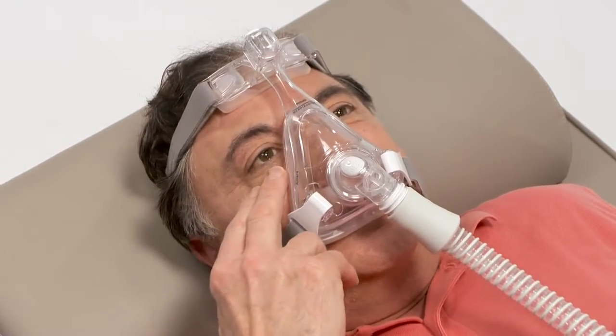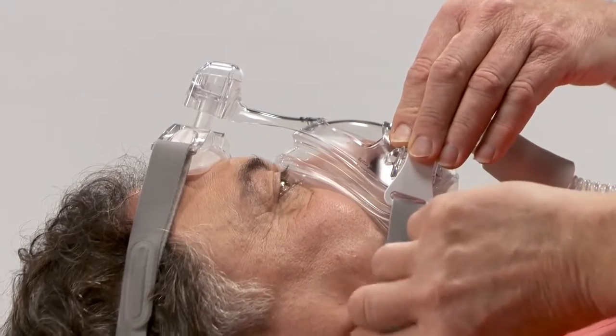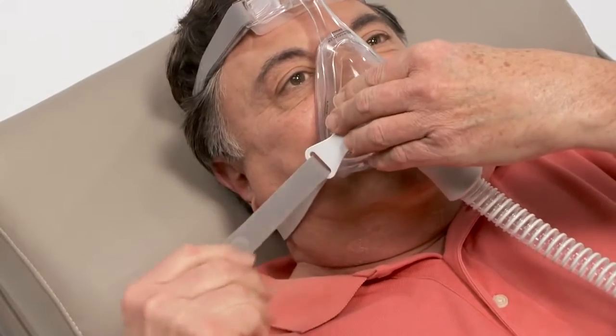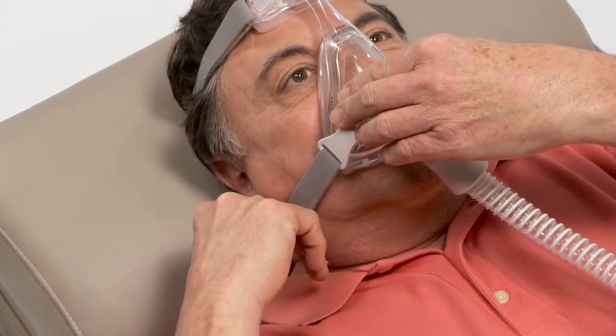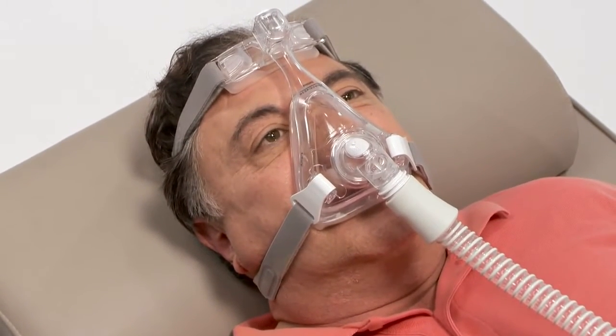If leaks are still present, apply pressure with your fingers directly to the mask in the location of the leak. If this eliminates the leak, tighten the headgear straps closest to the leak to accommodate the seal. Do not over-tighten the headgear.